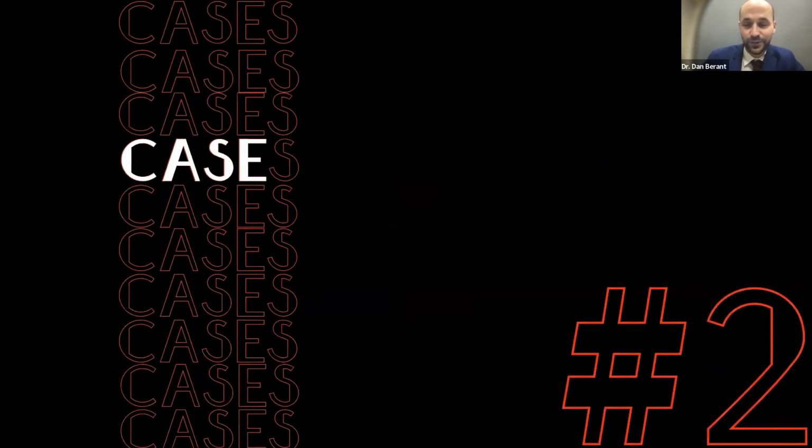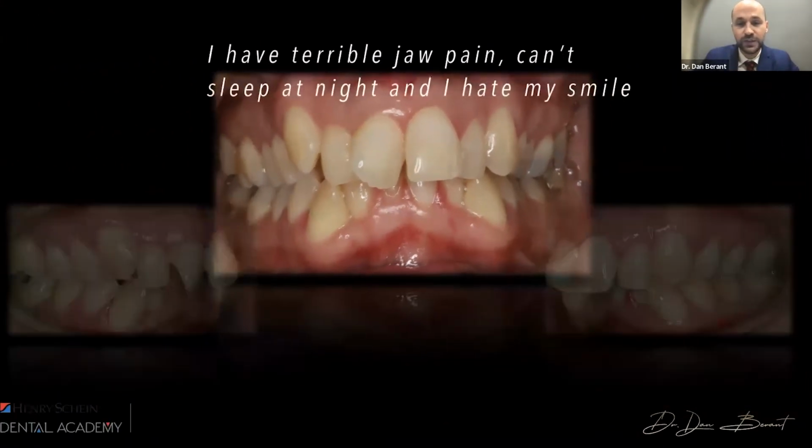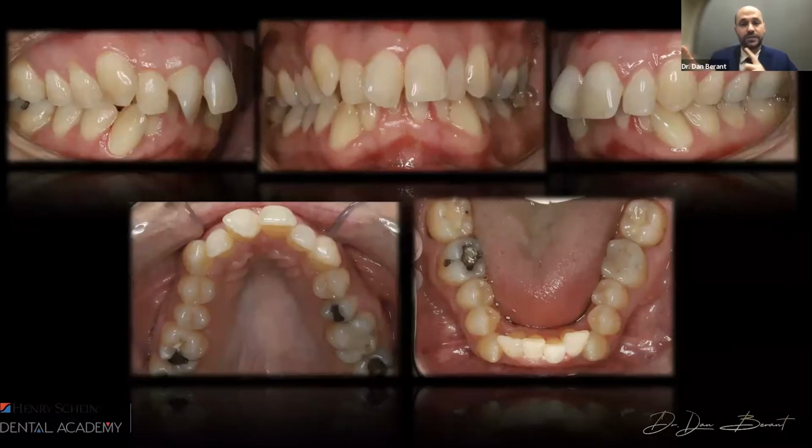So case number 2, if we could have spent an entire evening talking about a single anterior implant and all the nuances that go into it, we could spend an entire weekend talking about this patient who presented to me with a chief concern that she has terrible jaw pain, she cannot sleep at night, and that she hates her smile. And so through the utilization of a CBCT, I will showcase the treatment that we were able to render her, and also treatment plan both with oral surgeons, the periodontist, and the orthodontist. And so here are her initial photos of how she presents.